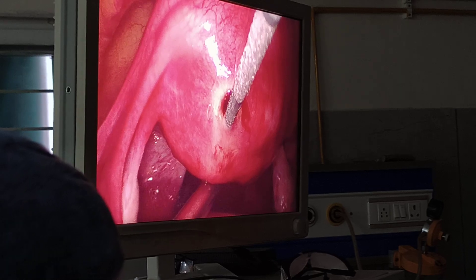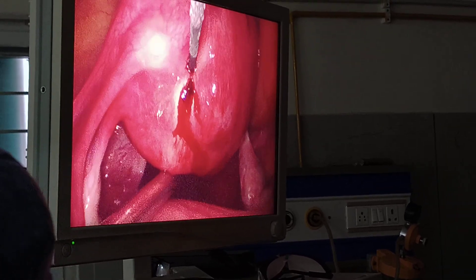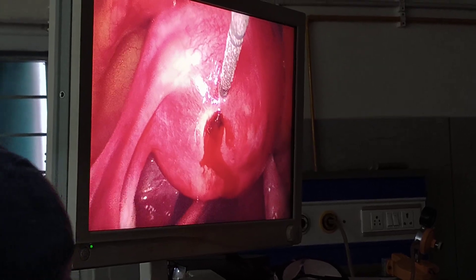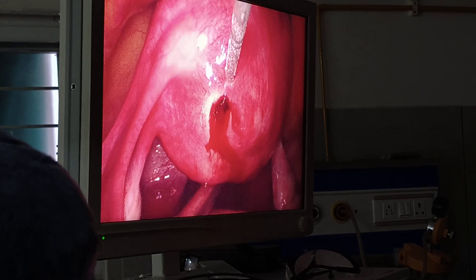See how the shrinkage is below. Wait — the point is here, you take here. Bleeding will stop now. See right around surrounding. Ablation.